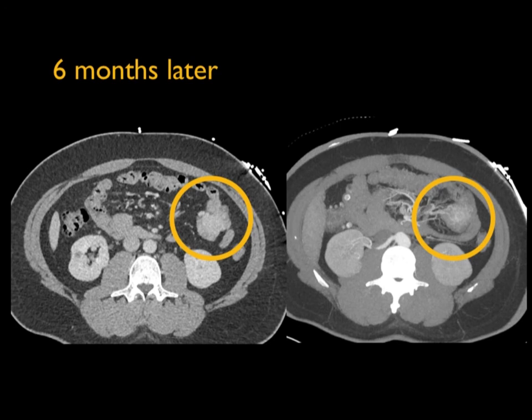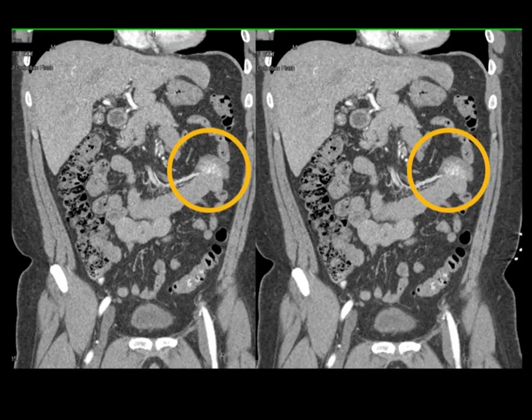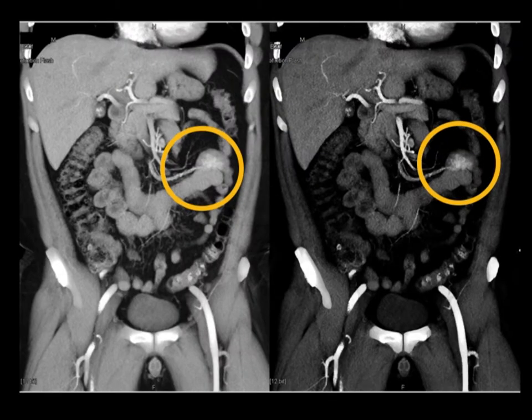You see the feeding vessels to the mass beautifully seen, and in coronal view, you see the mass as being exophytic to the small bowel, very nicely shown on these two images. And as you go from the coronals to the volume rendering, you really do appreciate the lesion. And if you change the windowing a bit, look how bright that lesion is compared to adjacent bowel.